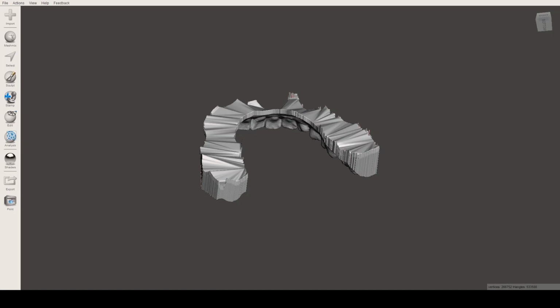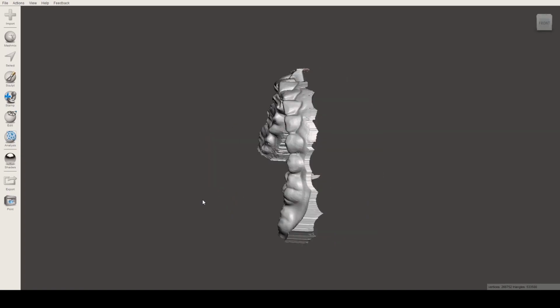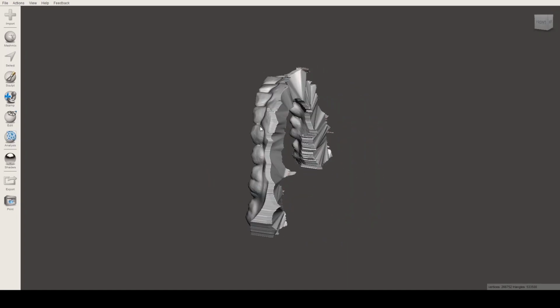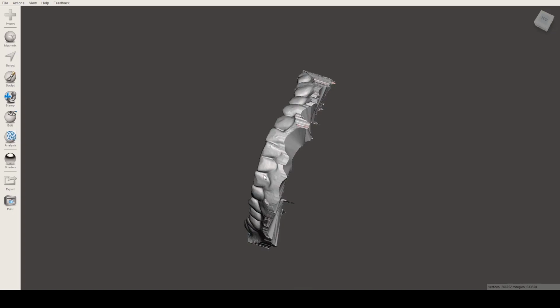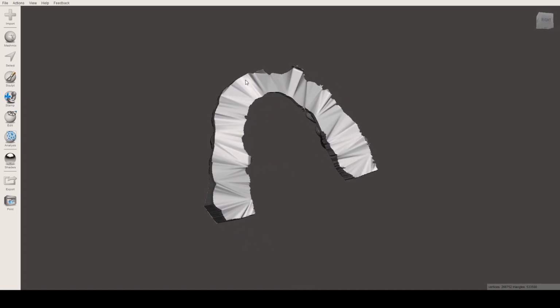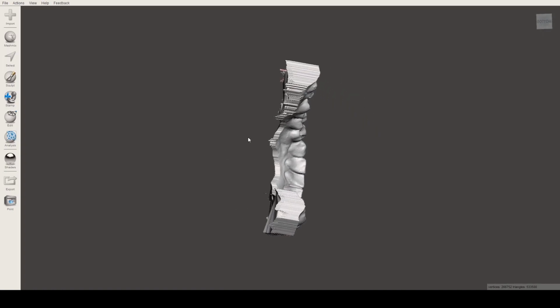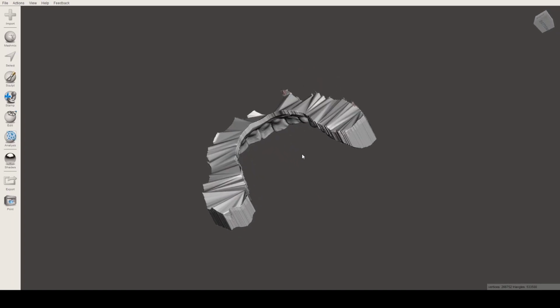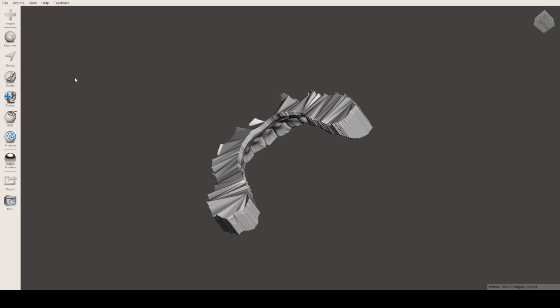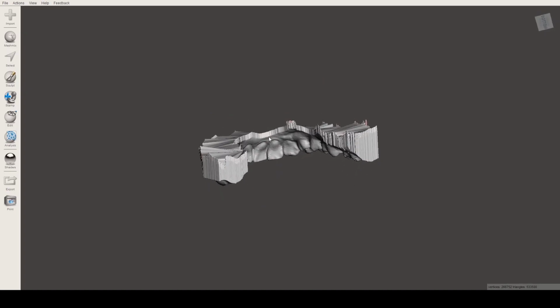So now that we open the file, we have here a set of teeth. I don't know what you call them. I'm not a dentist, but I'm gonna show you how to manipulate a model with this software, with Autodesk Meshmixer. What we have here is a model of teeth. You can manipulate them. I mean, you can turn them around, or you can move them around by pressing your right click, not your left click. Never your left click. Your left click is used for this toolbar right here, or for transforming the object or the model. But well, you can also use your scroll.